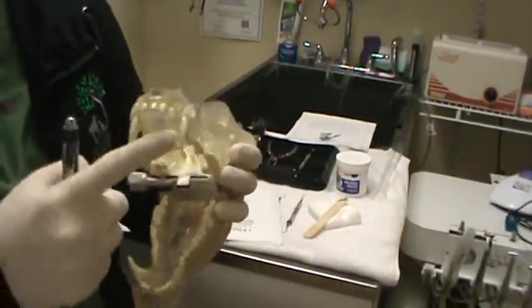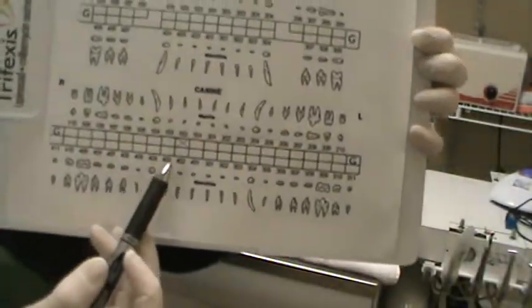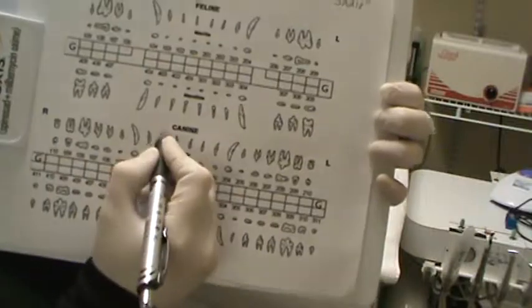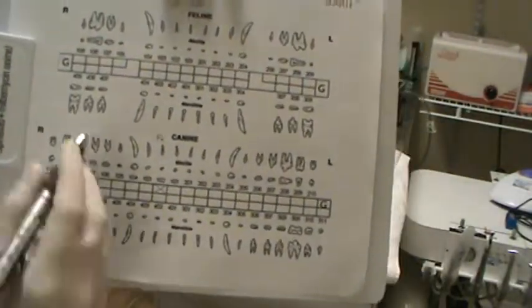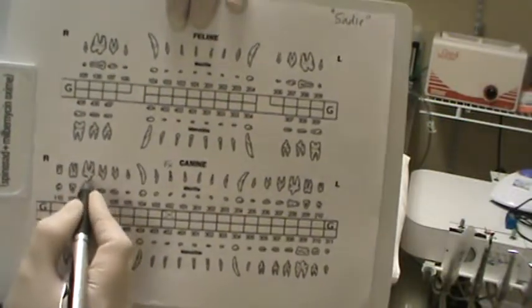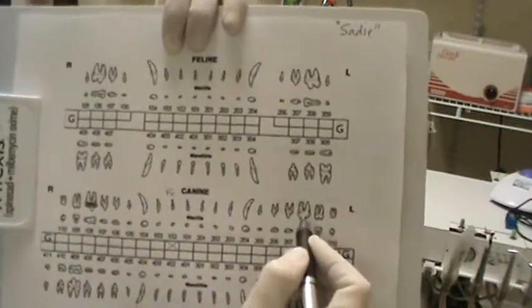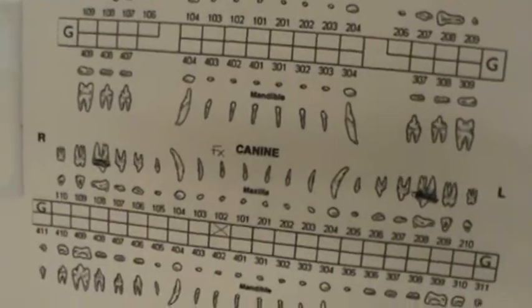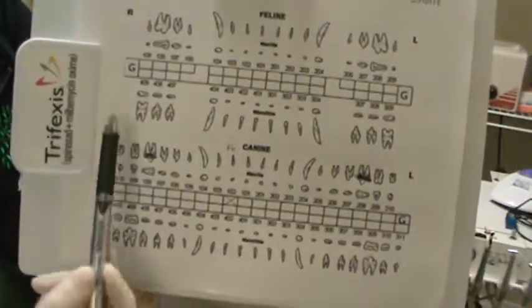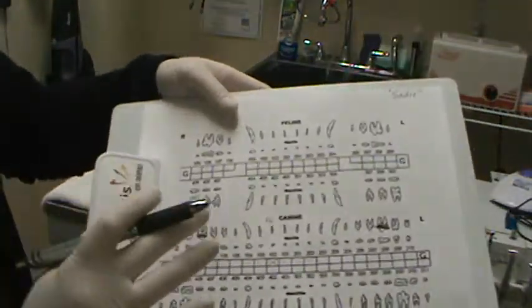Going on this model we have those teeth labeled, so we have that nicely marked that we extracted tooth 102, and it was fractured — we'll just write FX above it. That's really the only tooth that we had trouble with. If we have excessive tartar, which we did on the upper PM4s — the carnassial, which is number 108 and 208 — sometimes we fill in a lot of tartar, severe enough that we had to use those tartar chippers. There weren't any notable pockets on the quadrant that I cleaned.